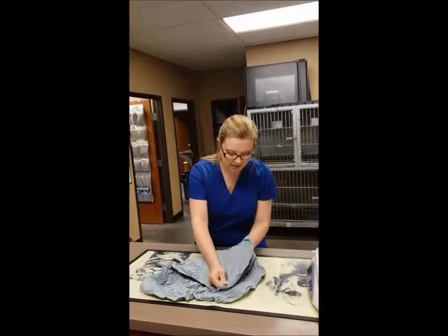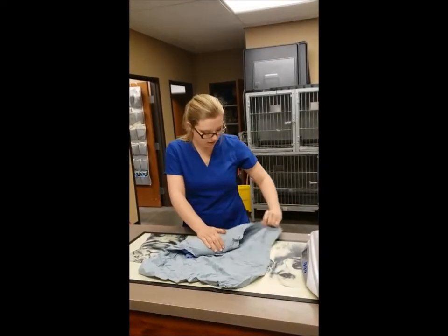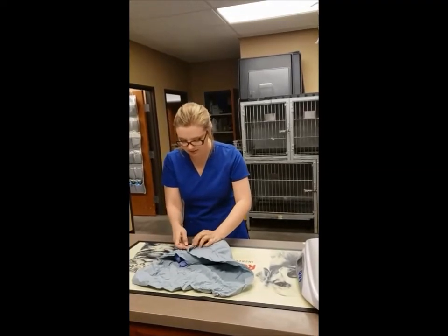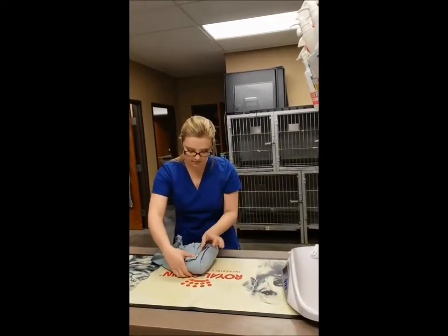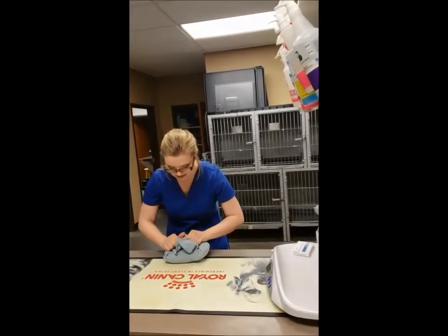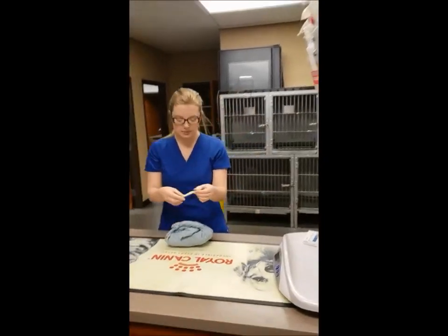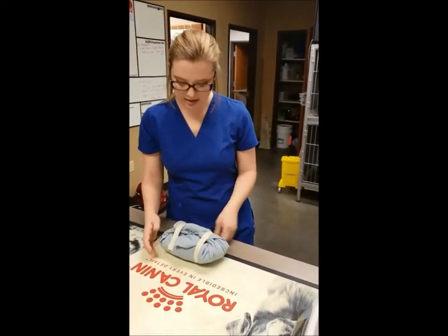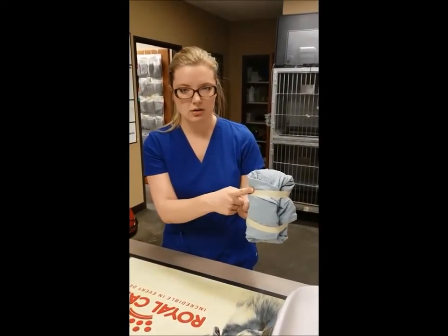And then I'm going to wrap this just like I wrapped the pack. Make sure that there are tags available so that our technician can open this when they go into surgery. So I've got my tag right here. I want to make sure that this is wrapped very tightly. Just like this, and I've got my tag sticking out here. And then you're going to use autoclave tape. This is also going to determine if this gown is sterile, because after this is autoclaved, these little white kind of clear stripes are going to turn black. And that's how you're going to know that this is sterile.